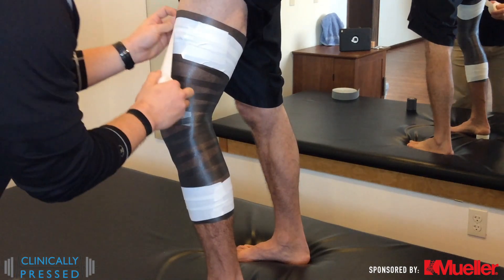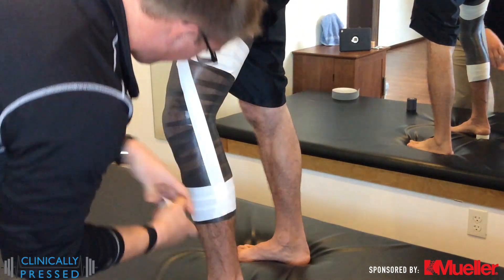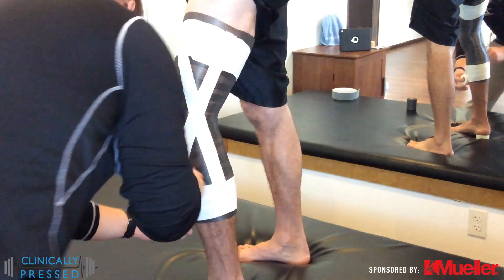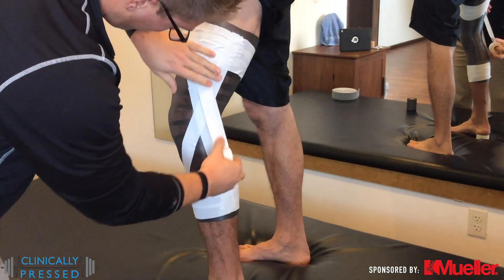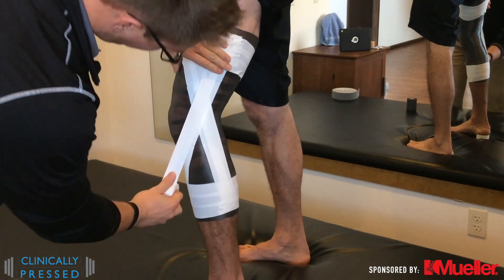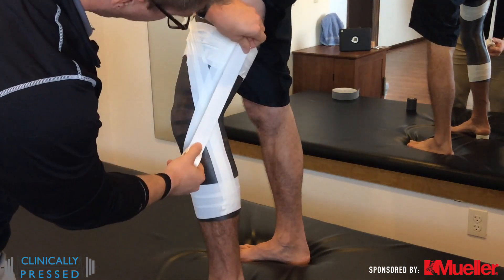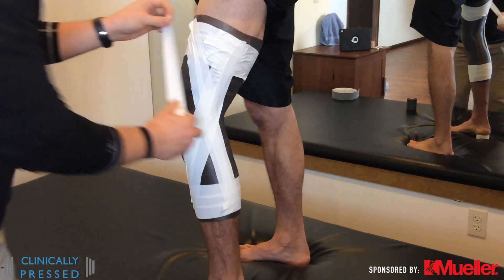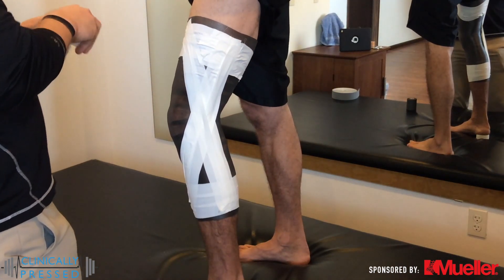From there we'll start our support strips. You can work superior to inferior or inferior to superior — our goal is to cross over the actual injured ligament or the one we're trying to protect. We can get off base unintentionally, and then the tape job doesn't give us the support we're trying to accomplish. We're utilizing white athletic tape here, but you could use the M stretch premium for more stretch and give. The 2-inch works well; depending on the size of the person you may go up to 3-inch for a larger knee. Not all strips will be perfectly on a crisscross over the target — we do want to fan it out to give support to the whole lateral portion of the knee, but that target area is our main focal point.